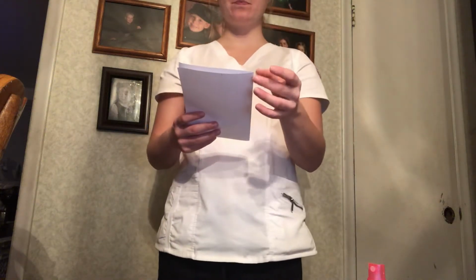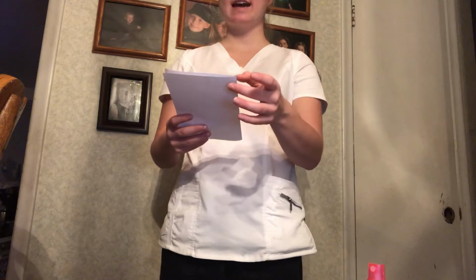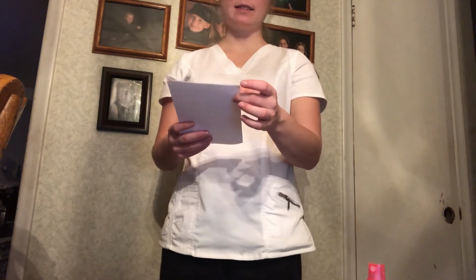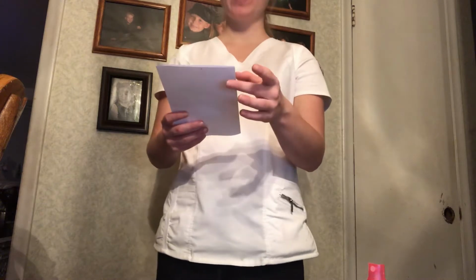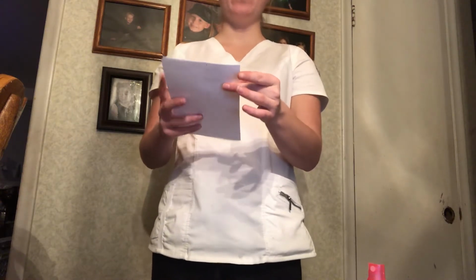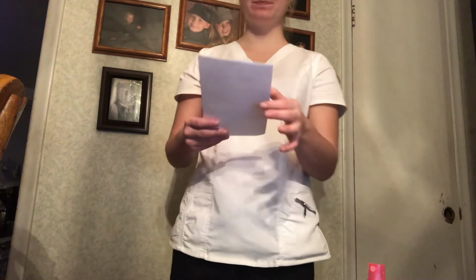So now that I've done all that, I'm going to check the MAR. I see that the patient is Diana Ramo. The time is 9 p.m. on 11/25/20. The medication is Lantus Glargine, 30 units is the dosage, and this is going to be a subcutaneous injection. Previous insulin injections were done in the posterior arm, so today we're going to do this medication administration in the abdomen, and typically this is administered 1 time at night before bed.